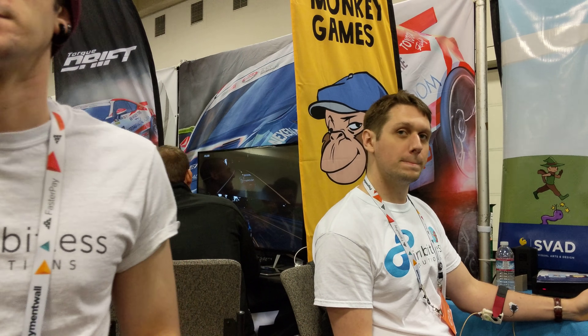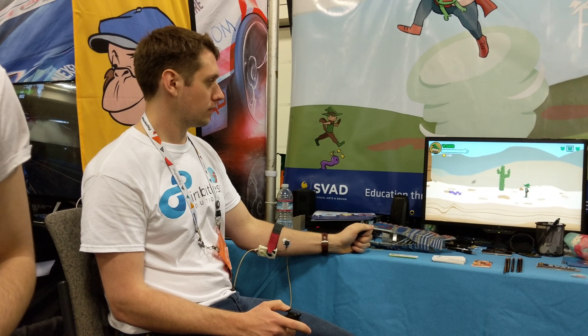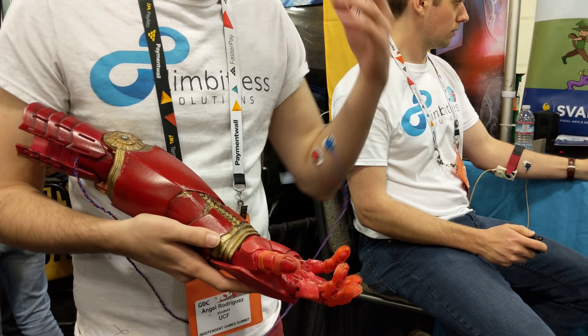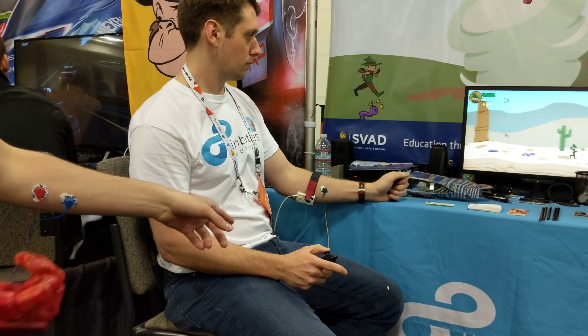It's made to be easy to port into any game. That's kind of cool because they can't use that hand for a controller anyway, so it allows them to basically use their other hand as a controller if they want to. In a lot of ways, that intent being translated into gameplay can be almost quicker than an actual button — and it works as a one-handed controller.